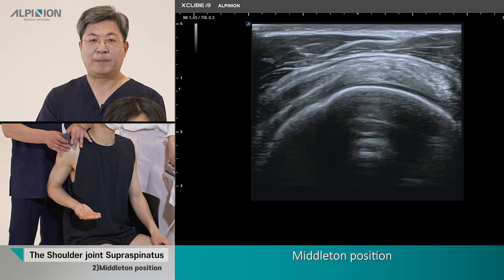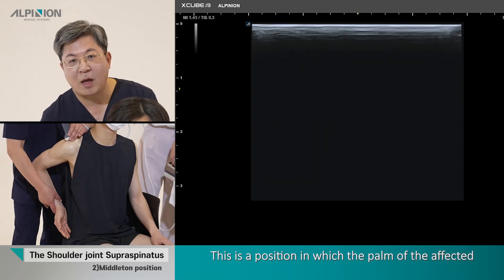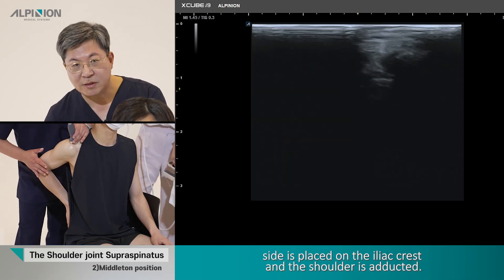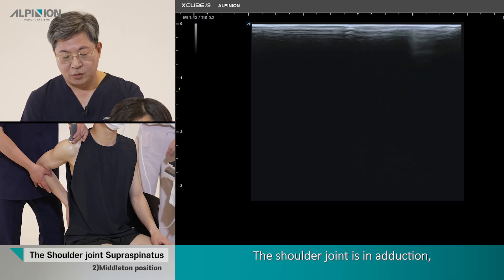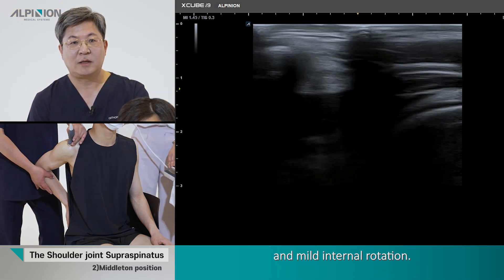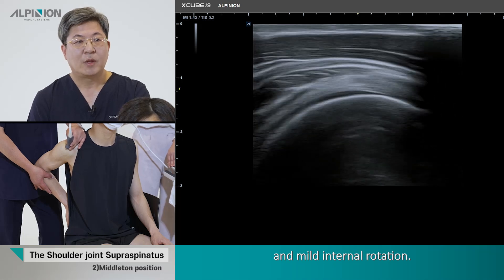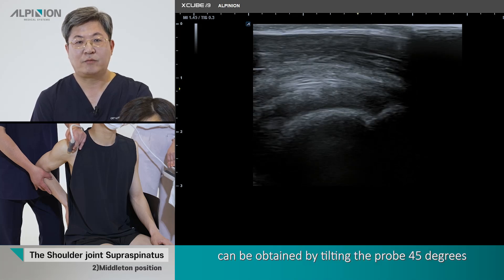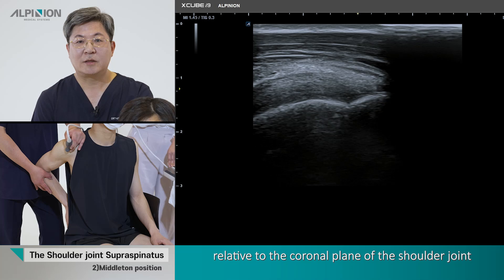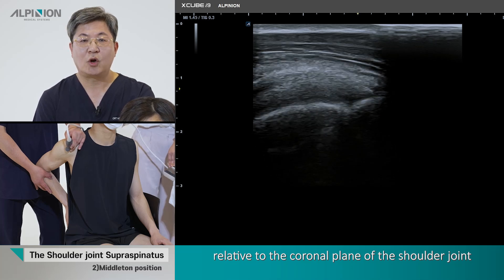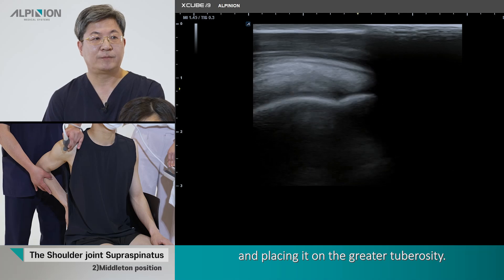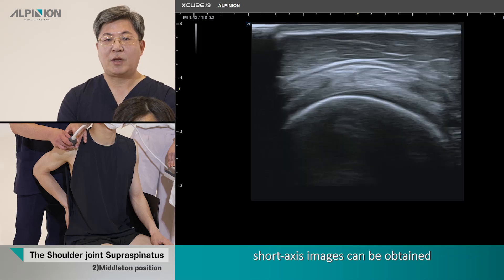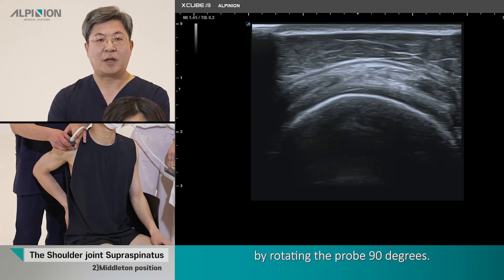In the Middleton position, the palm of the affected side is placed on the iliac crest and the shoulder joint is adducted, extended, and mildly internally rotated. The long axis image of the supraspinous tendon can be obtained by tilting the probe 45 degrees relative to the coronal plane of the shoulder joint and placing it under the great tuberosity. The short axis image can be obtained by rotating the probe 90 degrees.